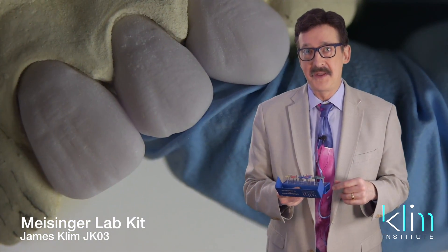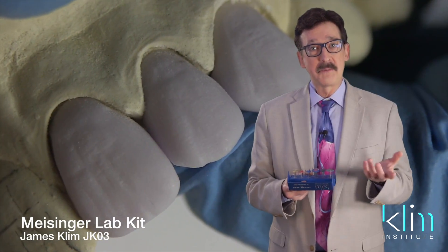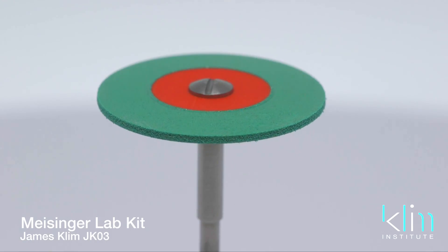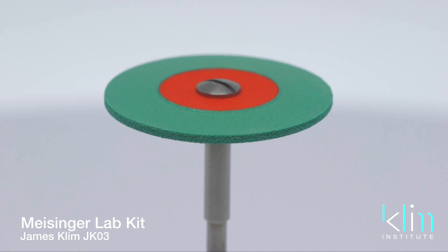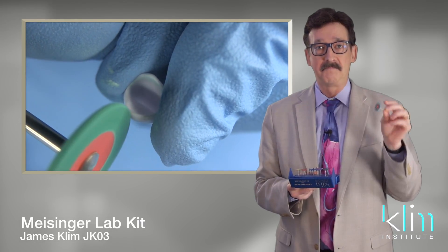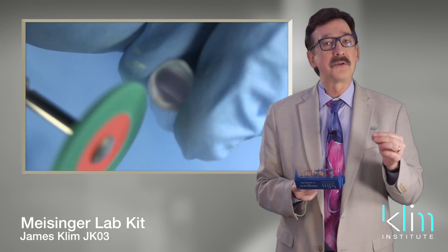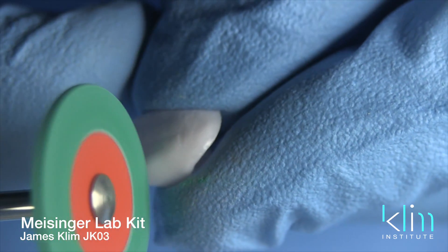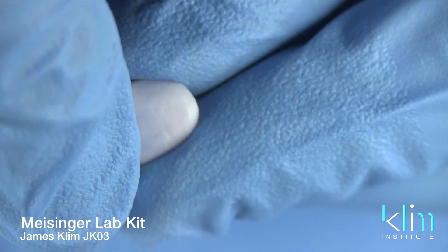We have videos that go through those aspects of using these burrs. As far as the polishers go, we have a coarse polisher. If I were stuck on an island and could only choose a few instruments to take with me, this would be one of them — it's a favorite. We can use it as a shaper and also as a polisher. The green is pre-glaze — I'll say that one more time: the green is designed for pre-glaze.